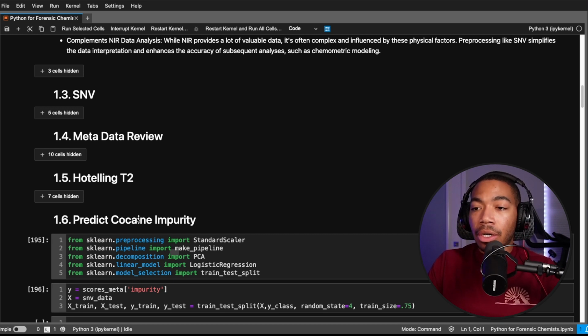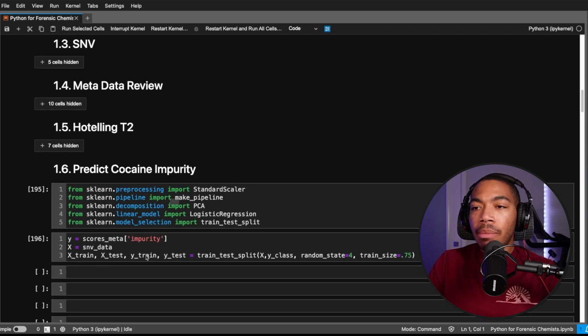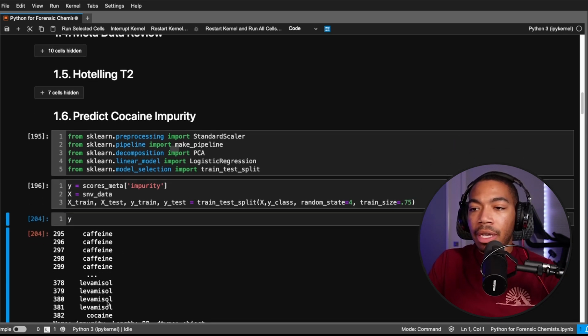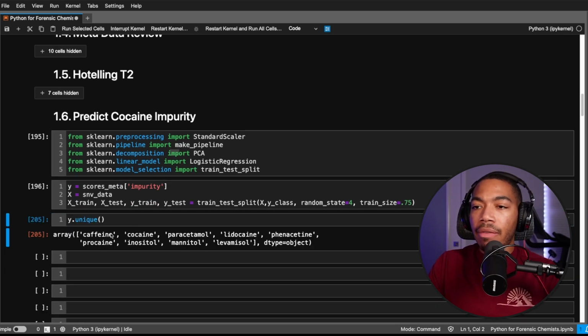So let's get started. I have already imported a number of libraries that we'll need for this particular video, and I have already set up some of my variables. So we have our Y data, in which case we're going to be predicting the impurity. If I run this cell, you can see our impurities are caffeine, levamisole. One way to look at all the variables is to use the unique method, and you can see we have our unique variables.